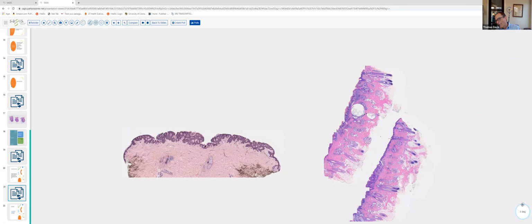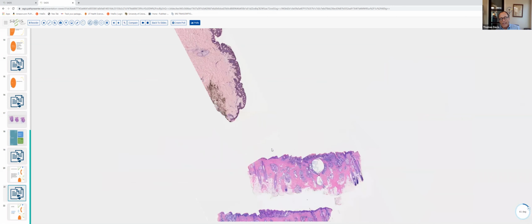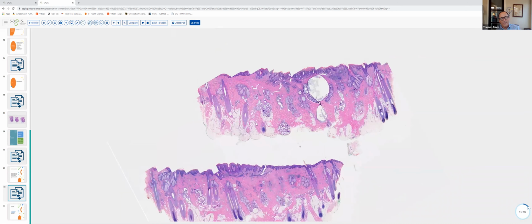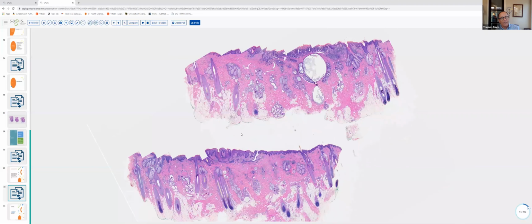We'll go ahead and compare and contrast this with, I'm going to tilt the slide here, nevus sebaceus. Here we've got an excisional biopsy specimen. One can again see these terminal hair follicles embedded down in the fat. What's interesting about nevus sebaceus is you have to step back and take a look.